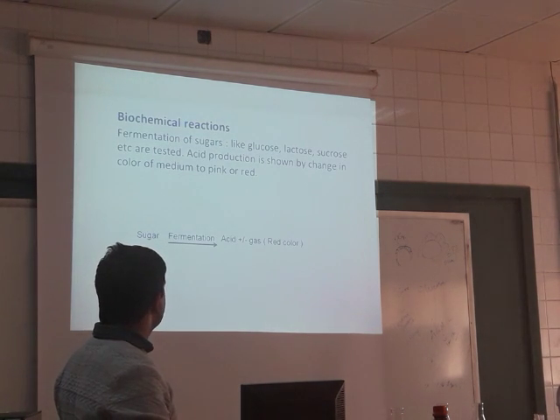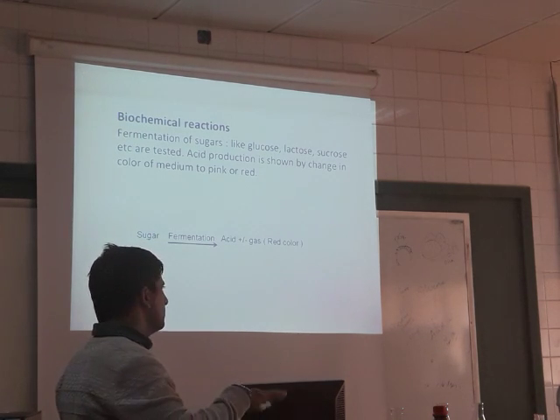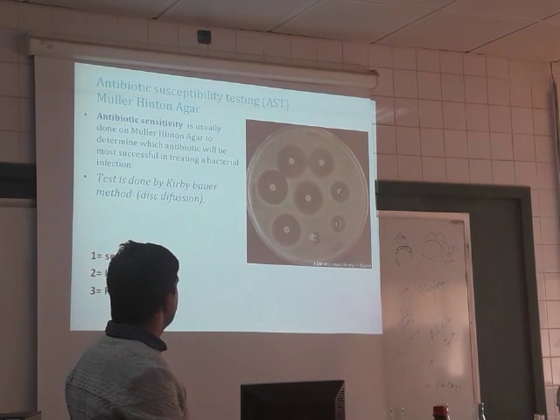We have discussed this. Glucose, lactose, sucrose, these are fermented. Either it may be acid with gas or neutral product. This is antibiotic sensitivity.